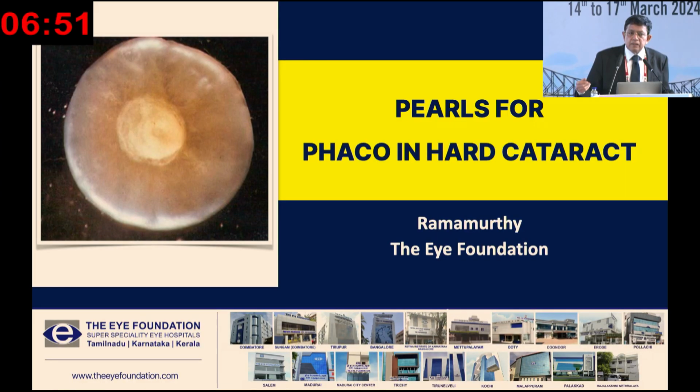Please remember, against-the-rule astigmatism and with-the-rule astigmatism have completely different connotations. So we put all these patients on the Barrett Toric Calculator and let the formula tell us whether the patient needs a toric lens. Subsequently, the counseling happens as to whether it has to be toric monofocal, multifocal, etc. So rather than just going by the magnitude of the astigmatism, take into account also the axis of the astigmatism, which is incorporated in the formula.